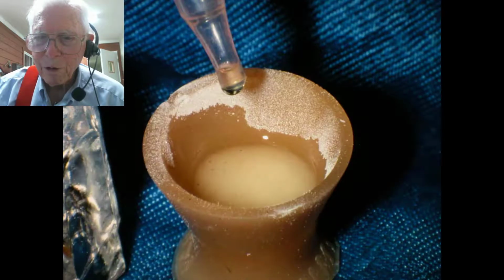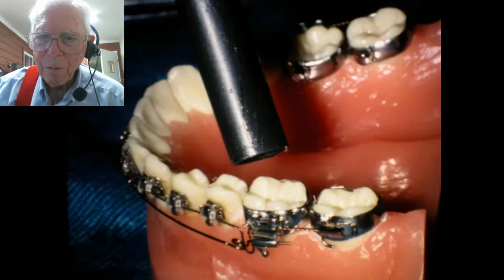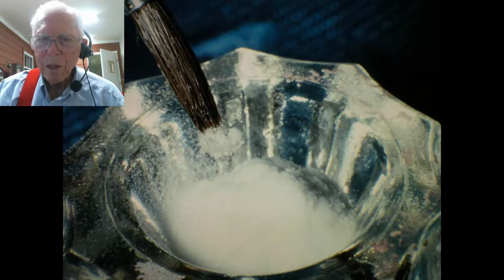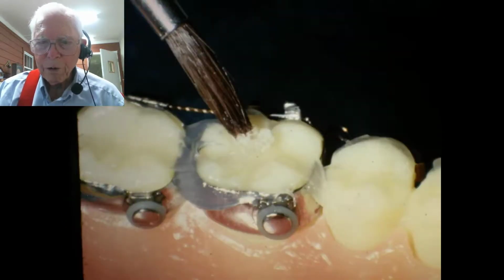Put a little liquid on this acrylic in here, and we're drying this off. And when we get ready, we dry that. We take a brush and some liquid and just put a little bit of acrylic on there, on the tooth. Now we're bonding with acrylic on an etched surface, so we put that on the surface where it's real liquid, and it soaks in good on there.